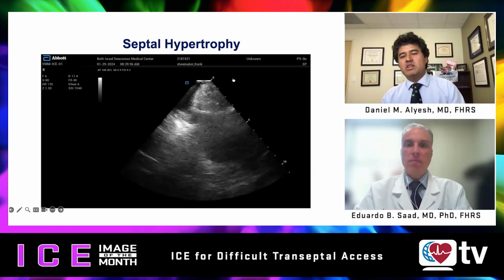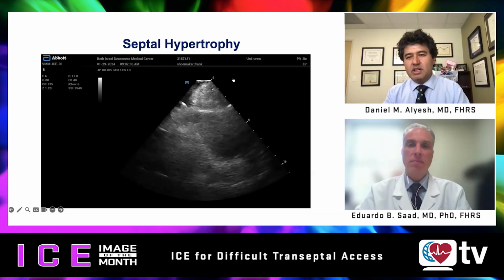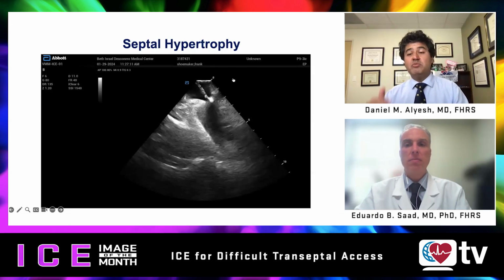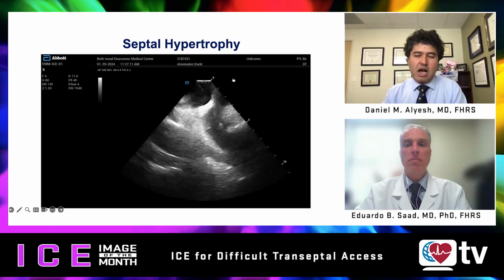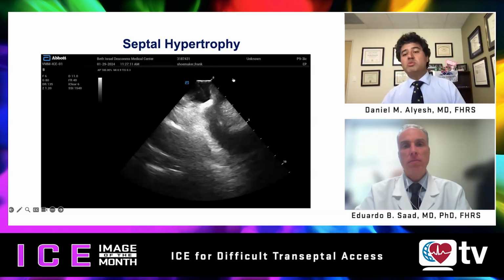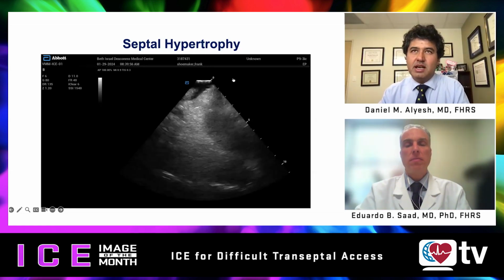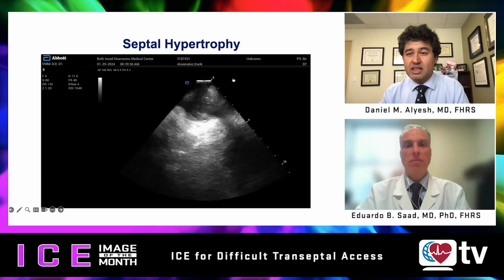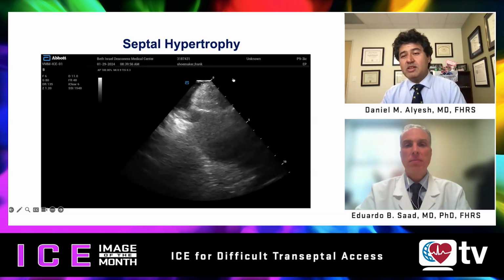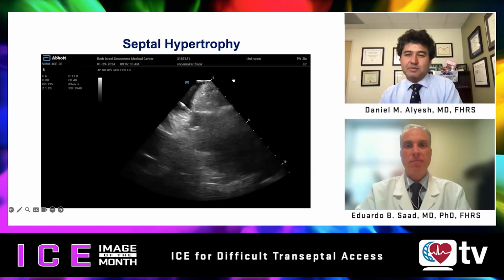I guess my final question for you is, as someone who has practiced in both environments, given the omnipresence of ICE in the U.S., and even here we're trying to push operators to do it in a more advanced way, then thinking of those barriers globally, the global adoption of ICE. Can you comment on your journey to using more ICE, and then maybe talk to our global audience and tell them the value of ICE and how can we more globally use it?